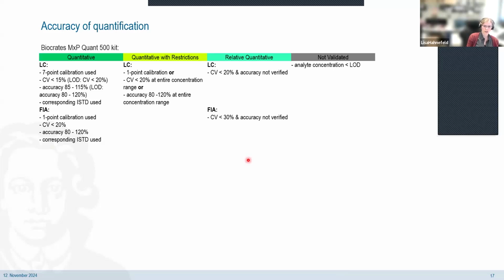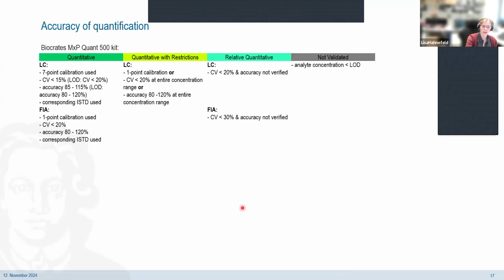Don't just take all of the compounds as equal, but look at how good the quantification accuracy is. Because if you want to assess a biomarker in the end and do a validation study, I think you have much better chances if you are in this group rather than this group. So, of course, don't omit this group, but also try to consider using the more quantitative results first.